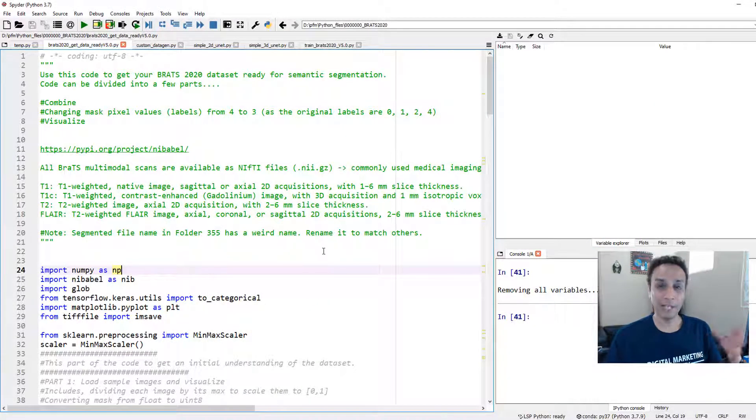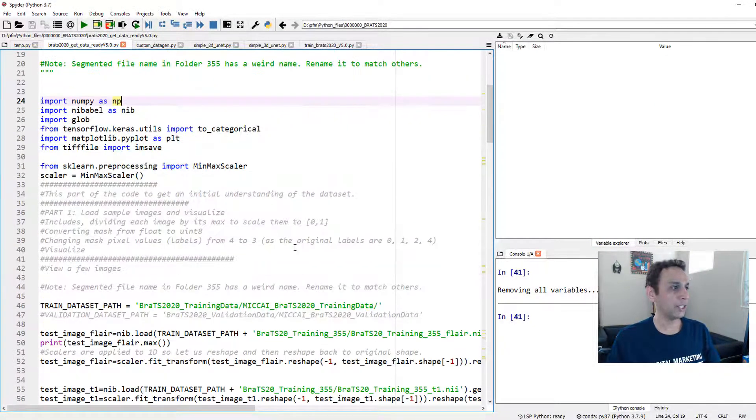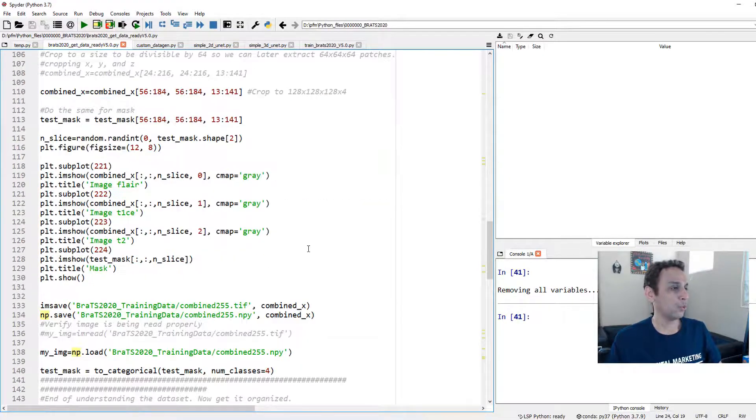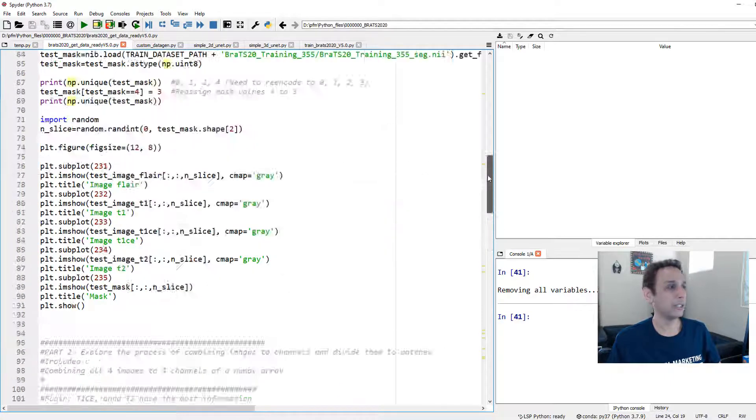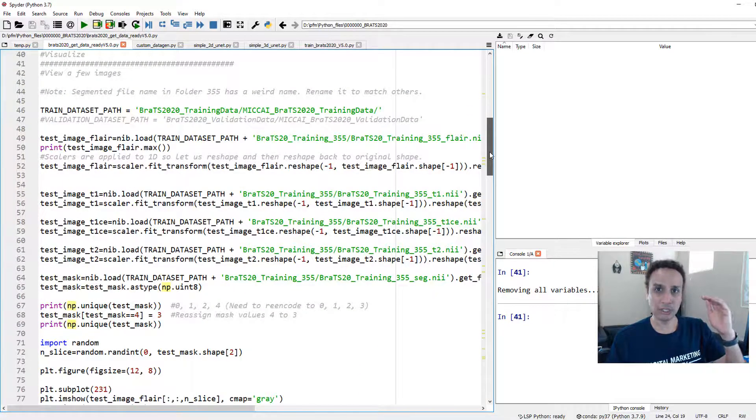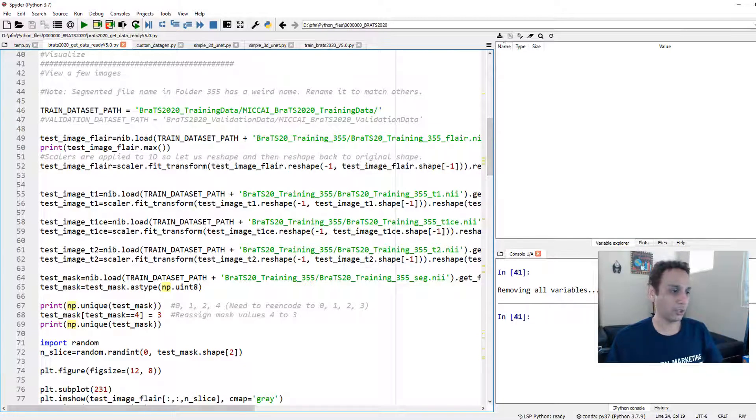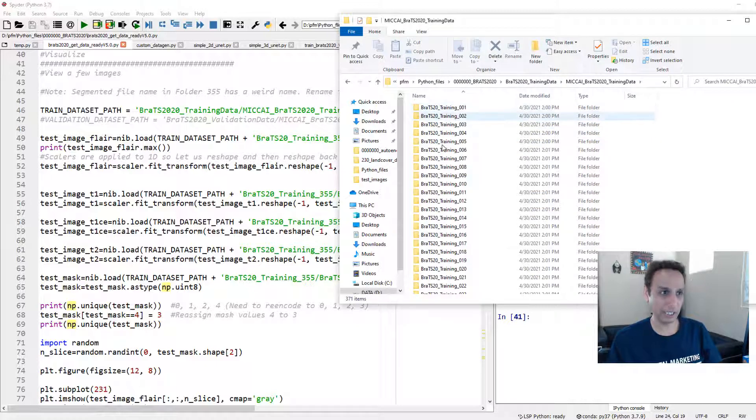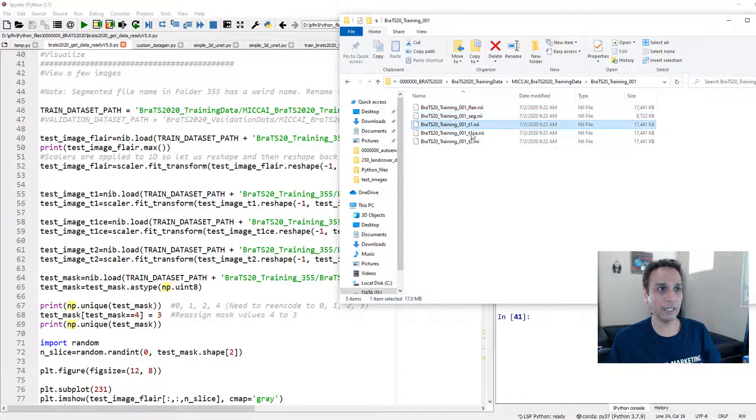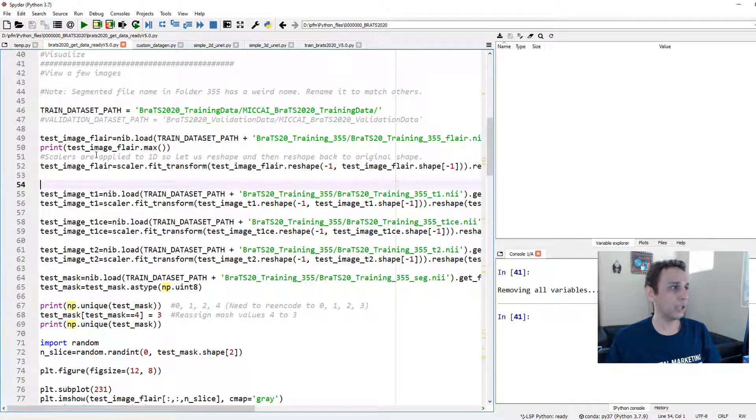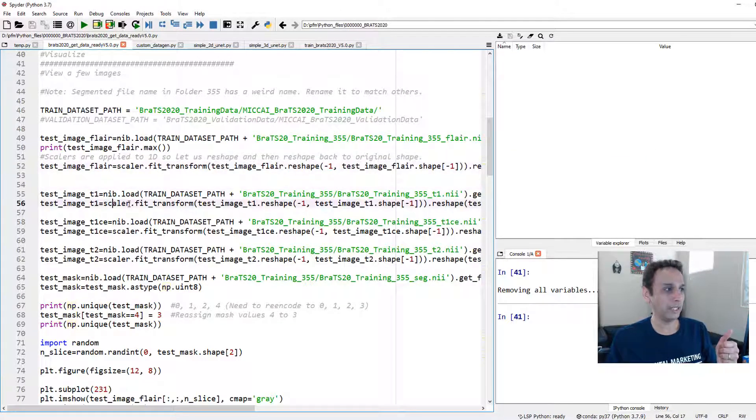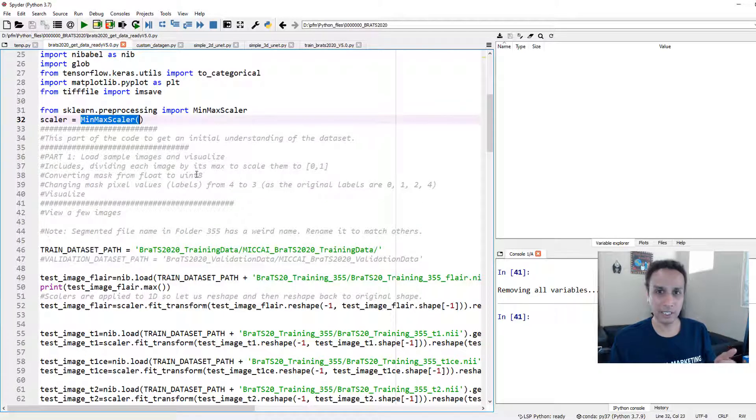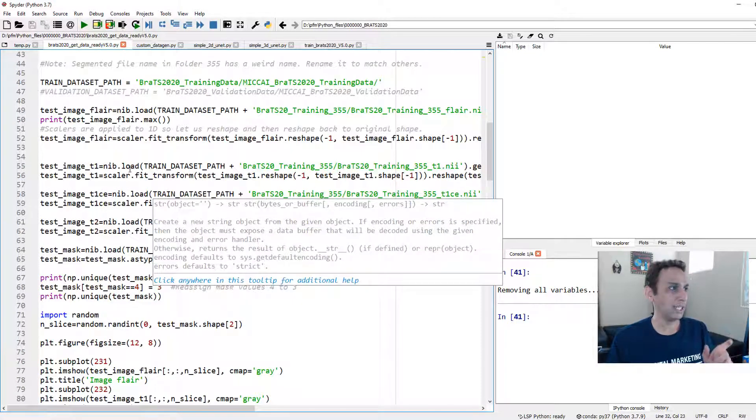Then let me go ahead and look at the annotations. We looked at labels like 0, 1, 2, and 4, and then we reassigned 4 to 3 because label number 3 is missing. So we did that and we converted the data to categorical and we merged some of these channels.